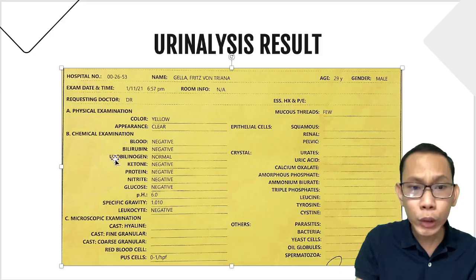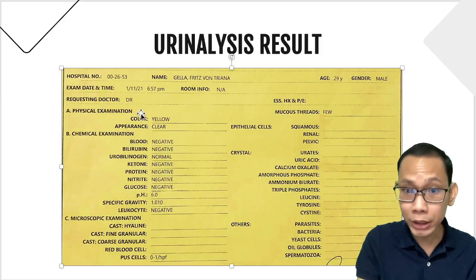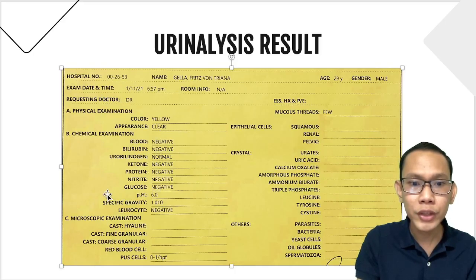That's why na-include na lang siya sa ating chemical examination. But then again, it should still be part of the physical exam parameters. Okay? So, wag lang kayong ma-confuse bakit nandito yung specific gravity, kasi nga, na-assess siya sa ating reagent strip.